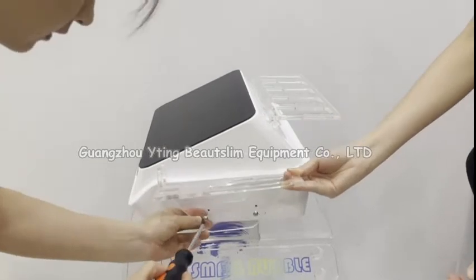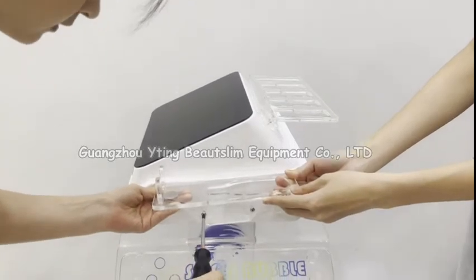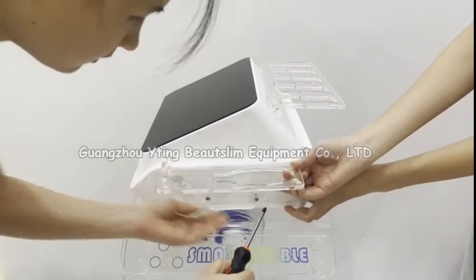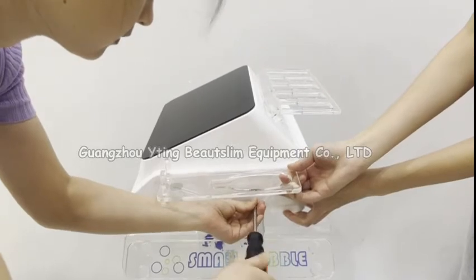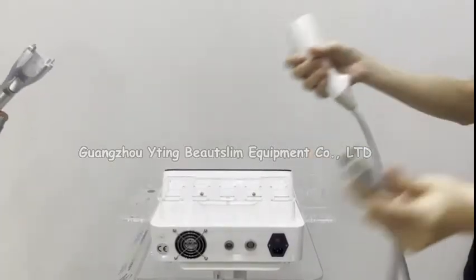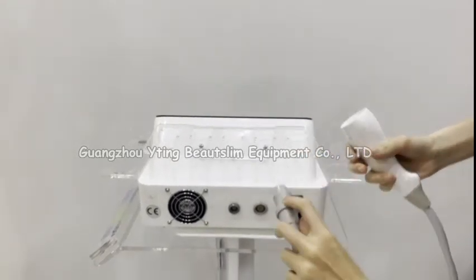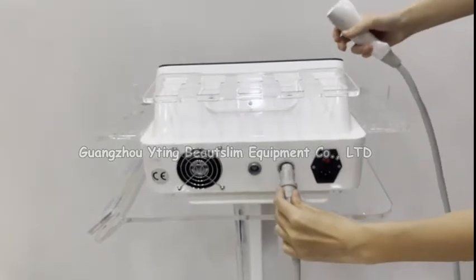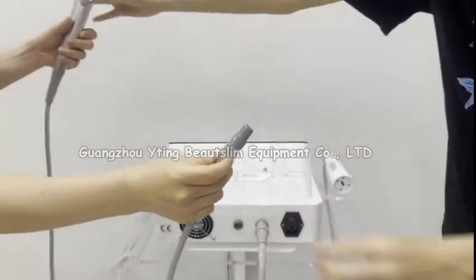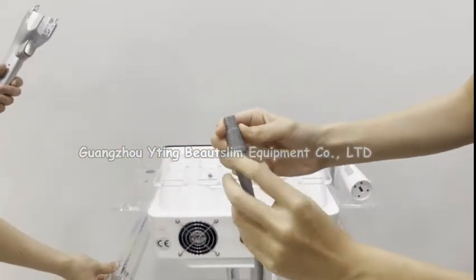Connect this one here. Connect this handle here — you can see there is an arrow here. This handle also has an arrow; make it face up.